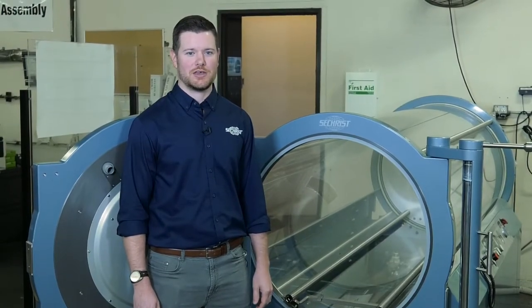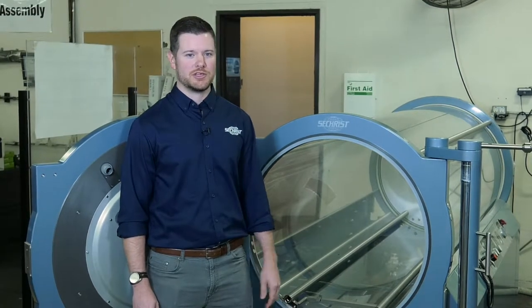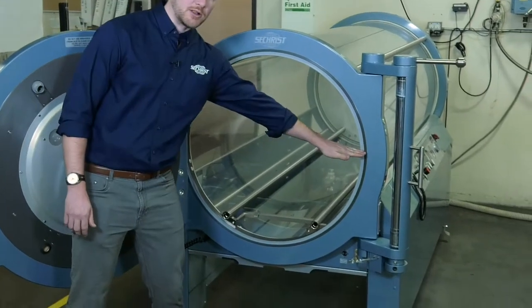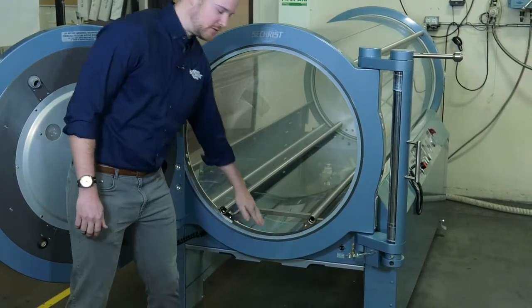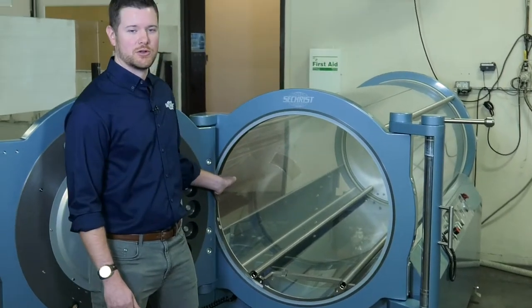Hi, I'm Matt Coleman. I'm a field service specialist with Sechrist Industries, and today we're going to be replacing a door seal. To make this process a little bit easier, we're going to imagine your door seal like a clock. This is the 12 o'clock position, this is the 3 o'clock position, this is the 6 o'clock position, and this is the 9 o'clock position. And that's going to help us orient the new seal as we're putting it in.